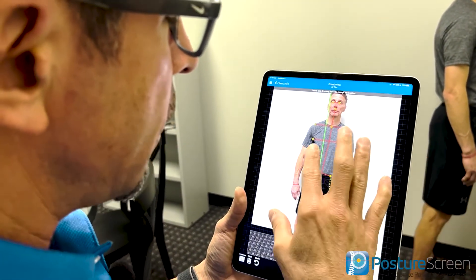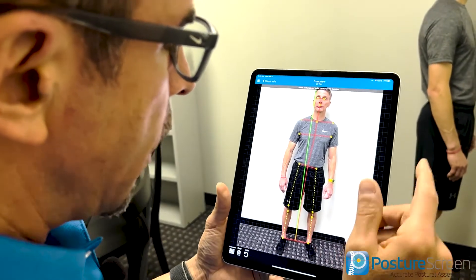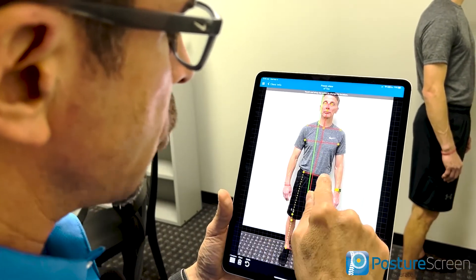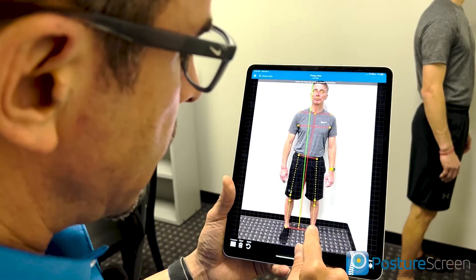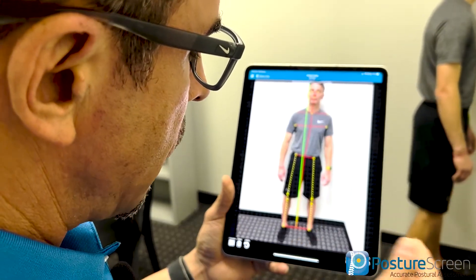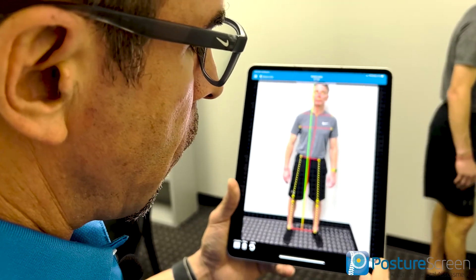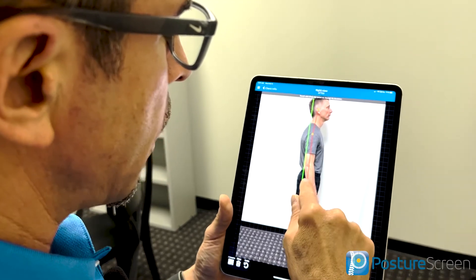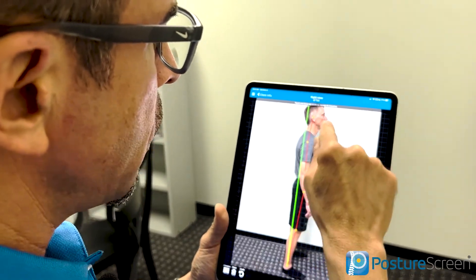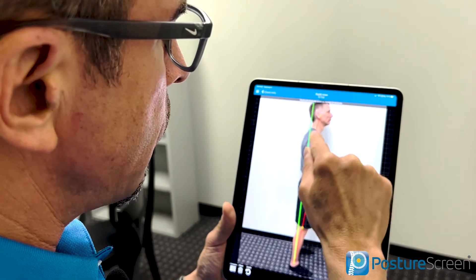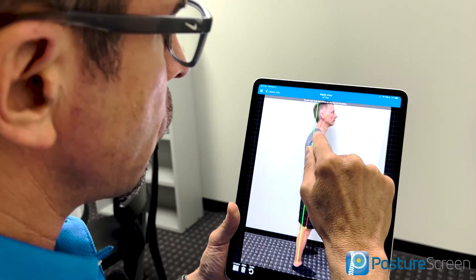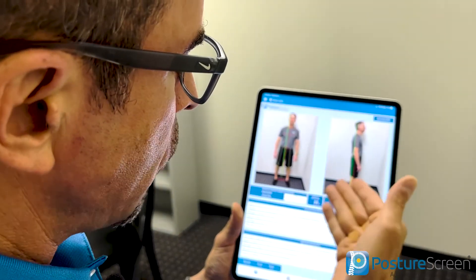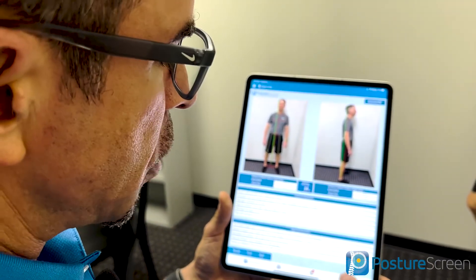At the digitization stage, if the client was standing crooked or you need to adjust any points, you can drag and correct them. From the side view, you can also correct points — for example, moving a point forward, positioning it to the external auditory meatus (EAM), or moving another up to the base center of the neck so the red line follows the neck correctly. Then the assessment is complete.